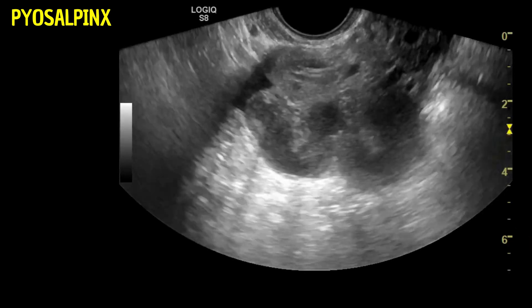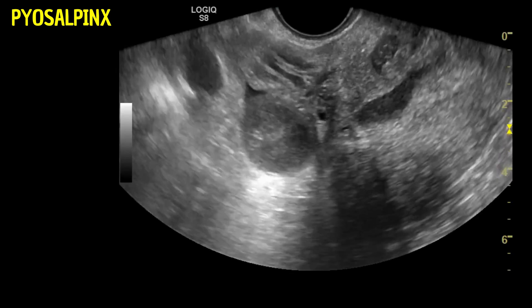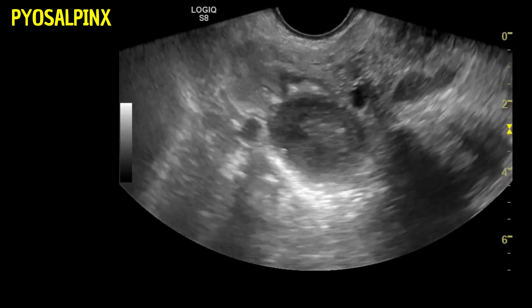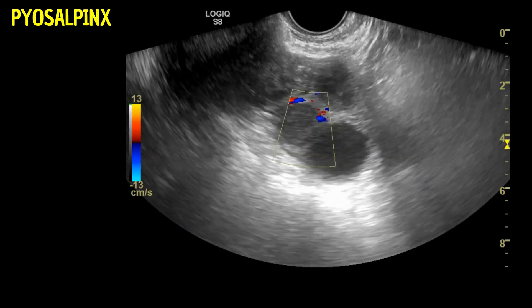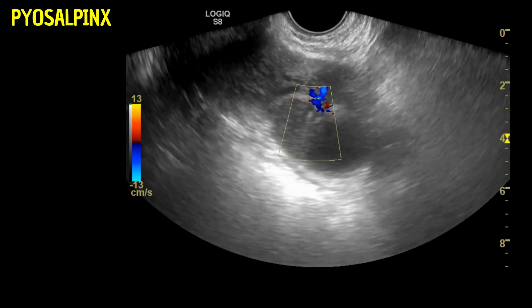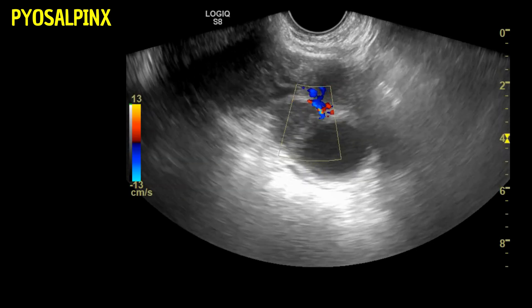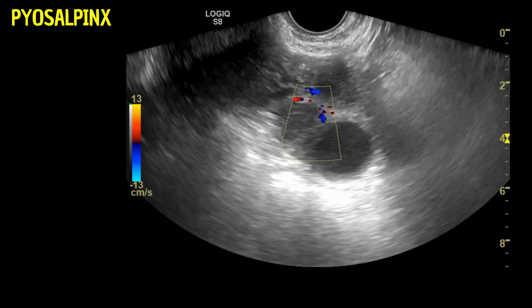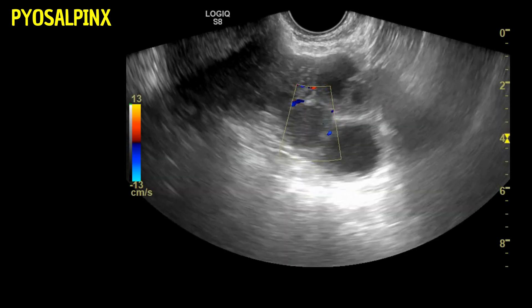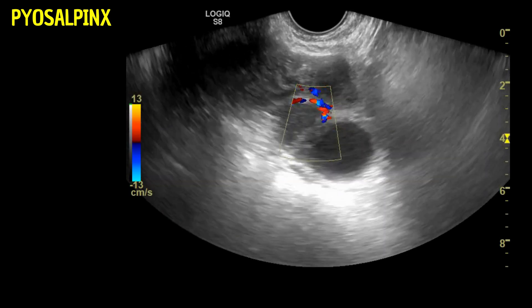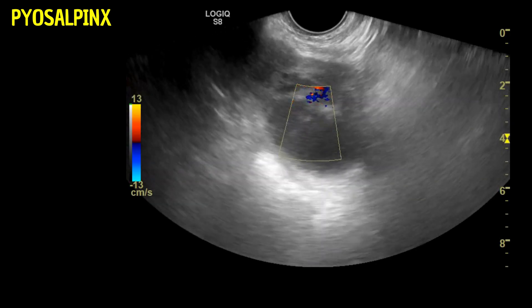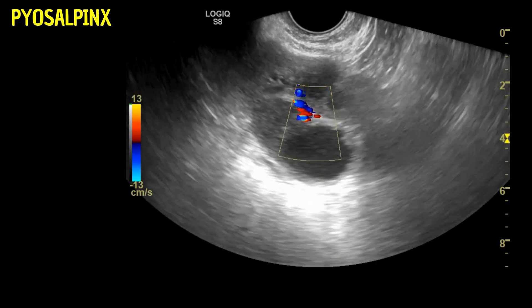The addition of color Doppler ultrasound provides further insights, revealing increased vascularity around these tubal structures. This finding is indicative of significant inflammation, a hallmark of pyosalpinx in the context of PID.